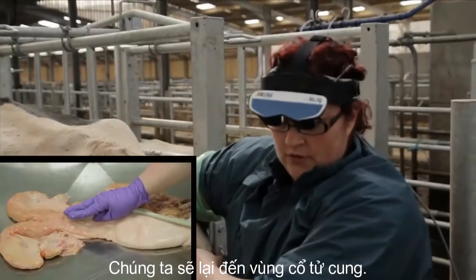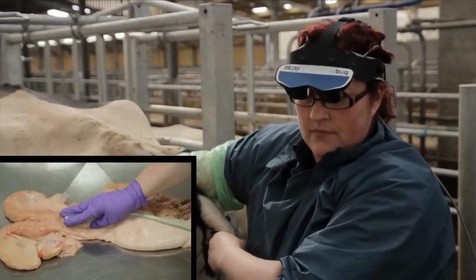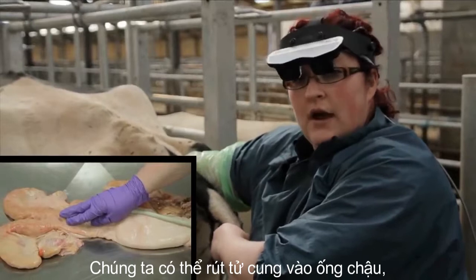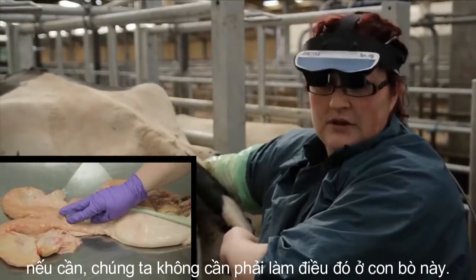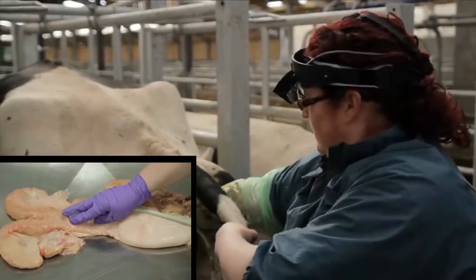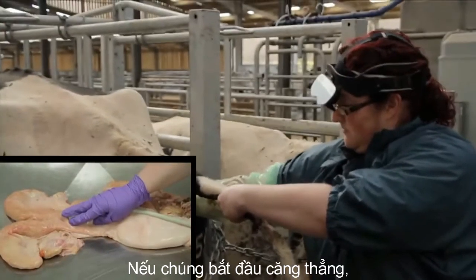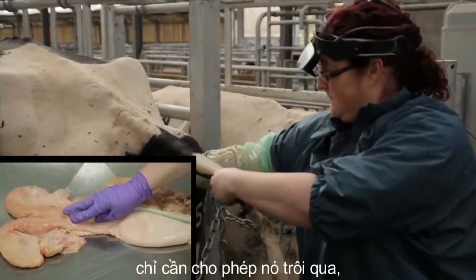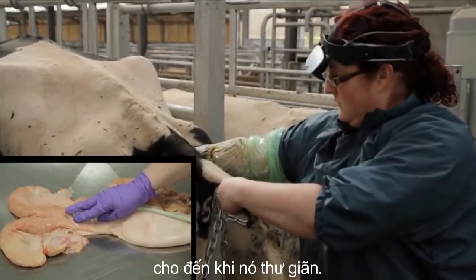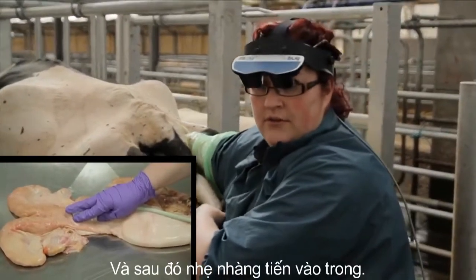We'll again come to the cervical region. We can retract the uterus into the pelvic canal if need be, though we don't need to do that in this particular cow. If the cow begins to strain, just allow it to pass until she relaxes, and then gently proceed inwards.